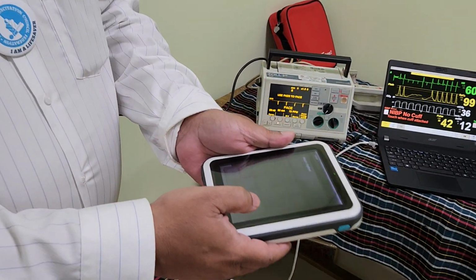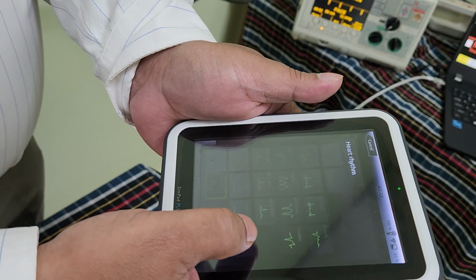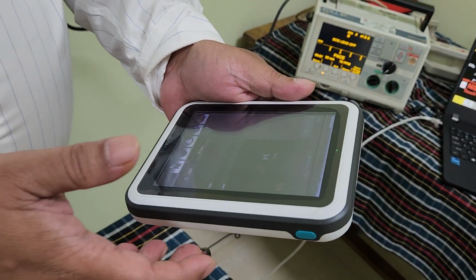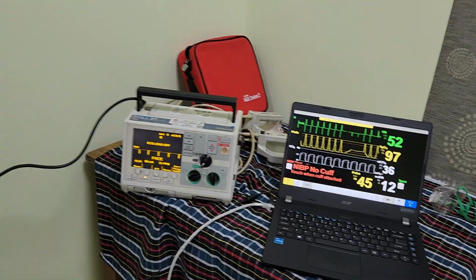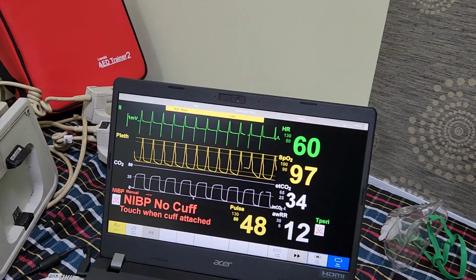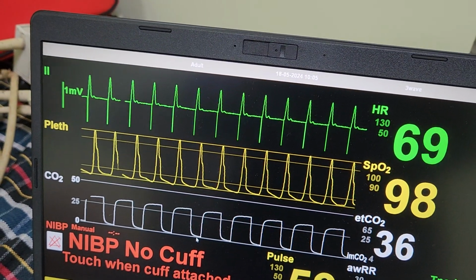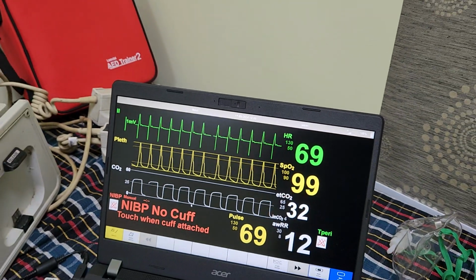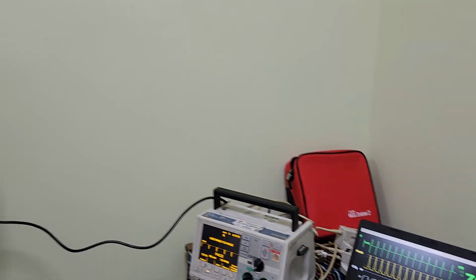This can be seen from the pacemaker symbol on this gadget. So this needs to be activated again. Once it is activated, the student should be asked whether they are able to see any changes in the pacing spike. Once the SIM-pad is configured to this pacing rate, the student should be able to identify that now each pacing spike is converted into an electrical capture. We don't see any lone pacing spike.